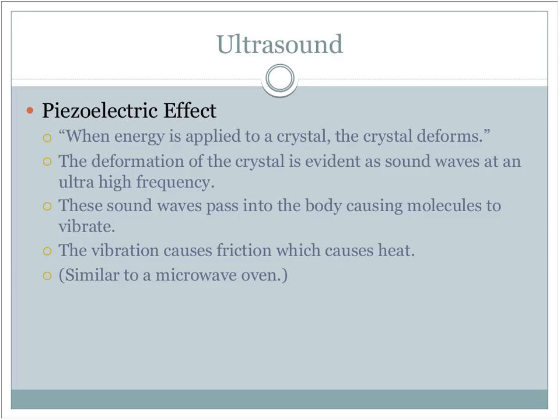There's a whole lot of terminology and physics behind the way that the ultrasound profile is coming out of the sound head, and I won't go into that detail because, quite honestly, I don't necessarily understand it that well myself. But if that's disrupted in any way or it's not grounded properly, you're going to get some of that irritation, and we shouldn't be doing that treatment, because then we don't know what kind of ultrasound waveform we're delivering to the patient.